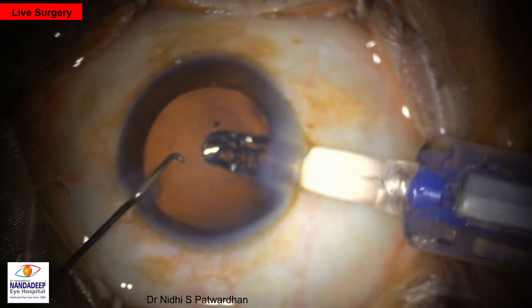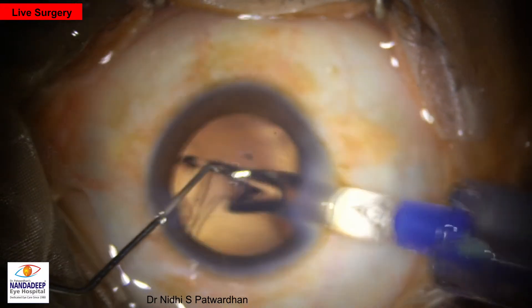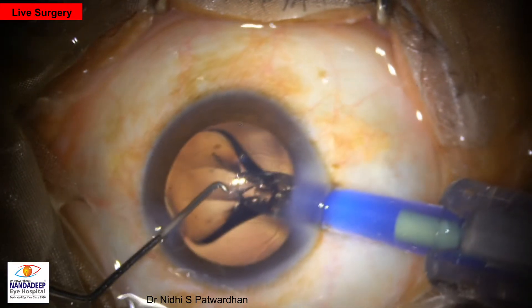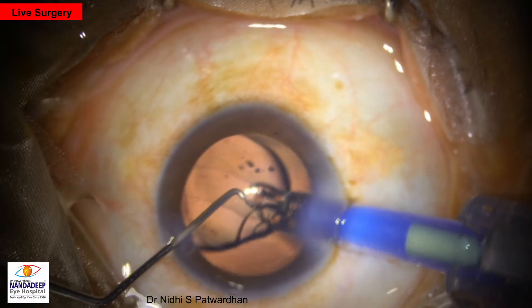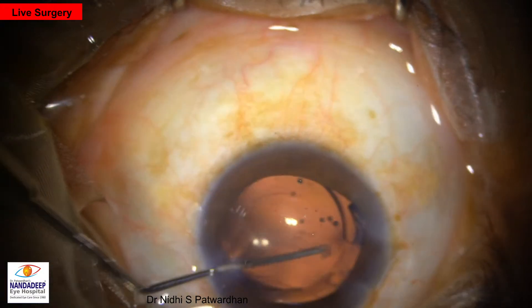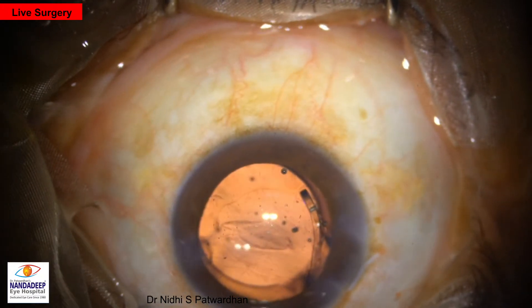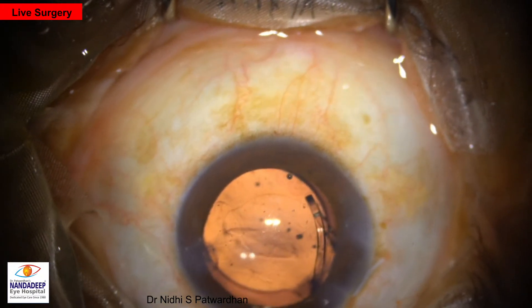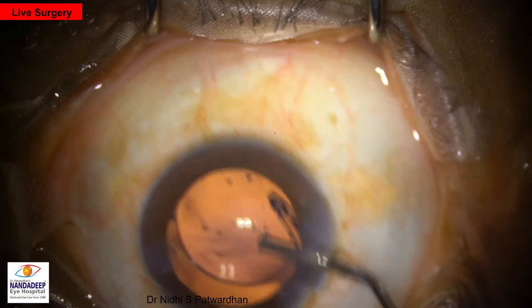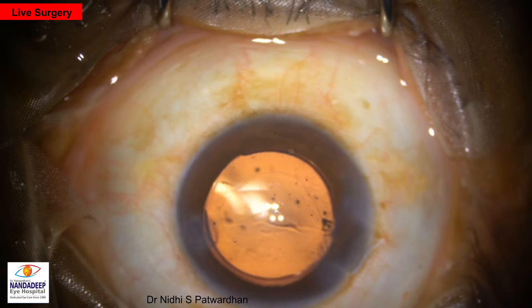The cartridge is introduced and very gradually — you can see the surgeon is moving slowly — and also releasing a little bit in between so as to avoid the haptic being captured around the silicone bulb, and to avoid pushing the blue silicone tip into the anterior chamber, because it expands after entering and you may have difficulty pulling it out. To place the IOL, push some viscoelastic and press the upper half of the IOL down so the haptic goes in the back.